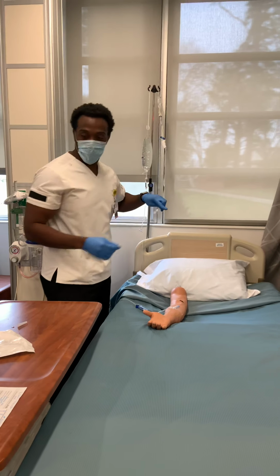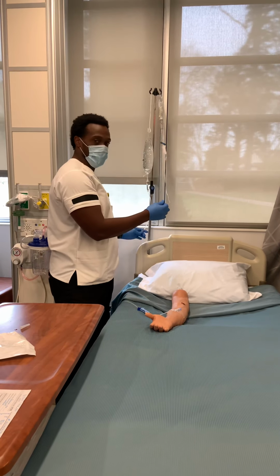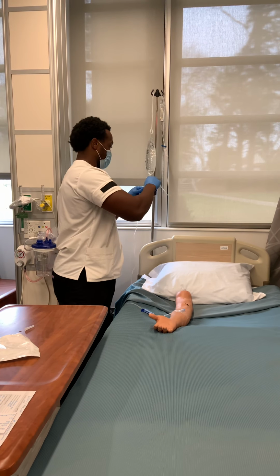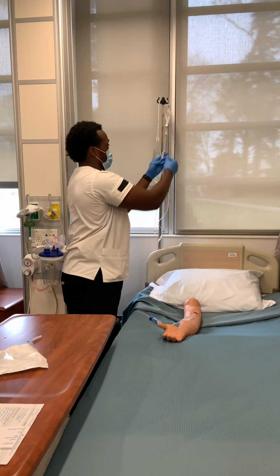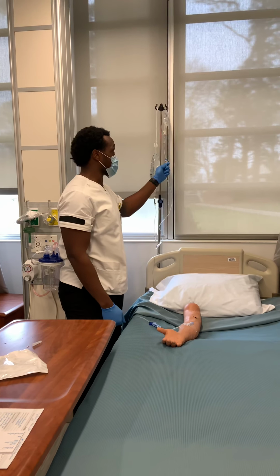And then I would just pretend. I would use an alcohol wipe to clean the port, and then I would insert into the port and open the tubing, and then make sure this drops 13 times within 15 seconds.